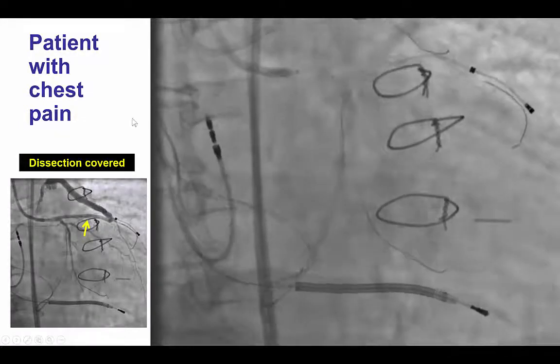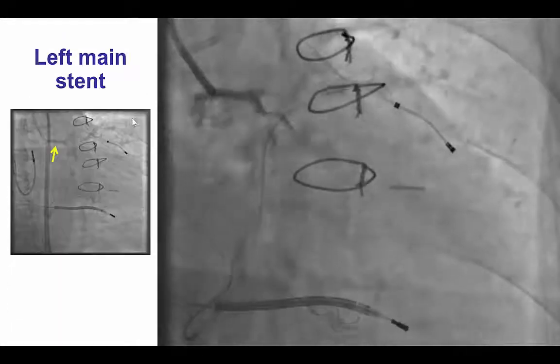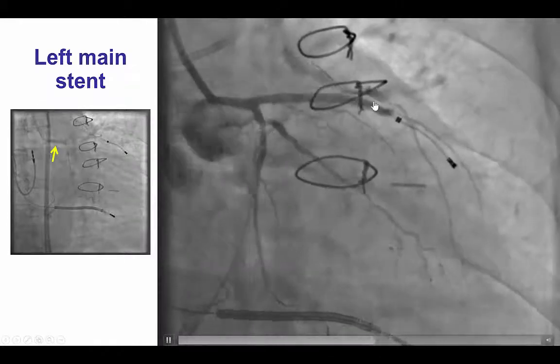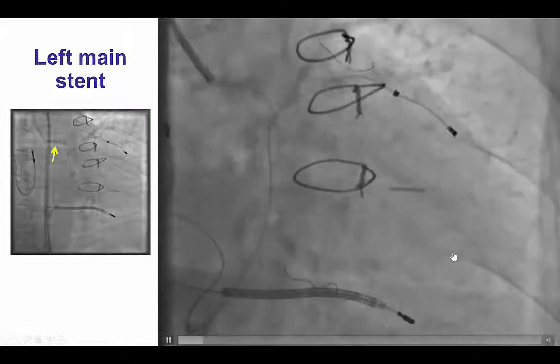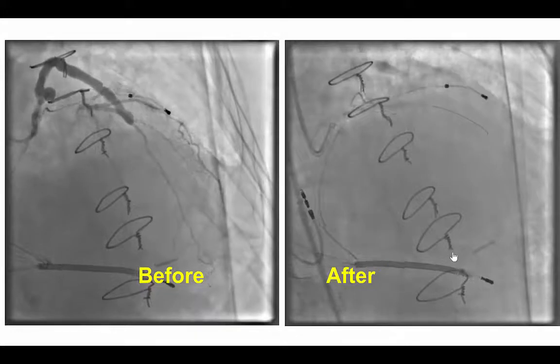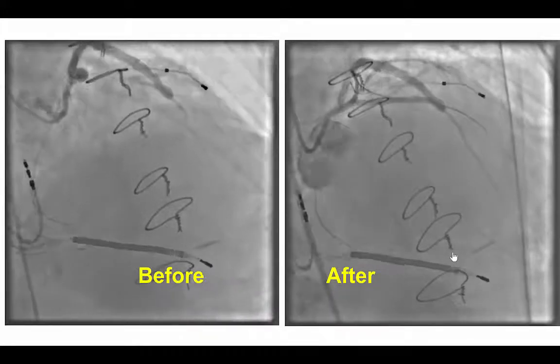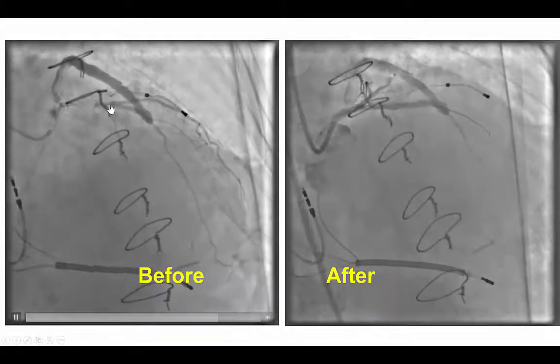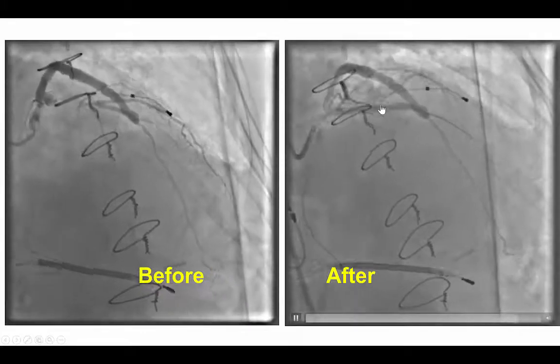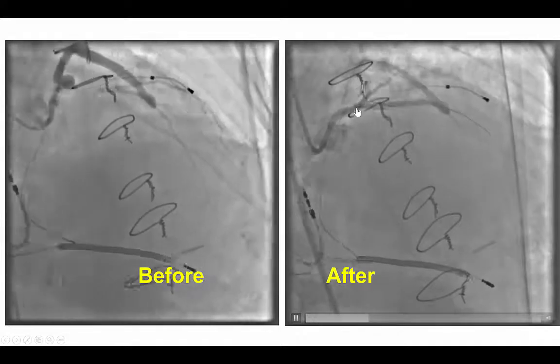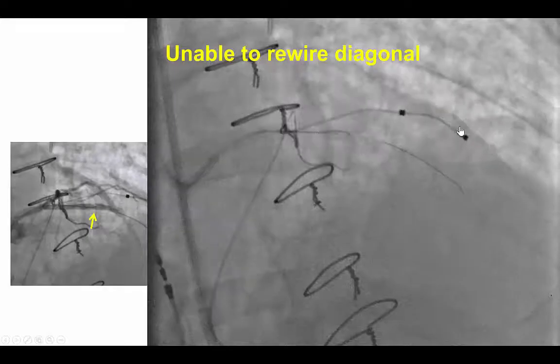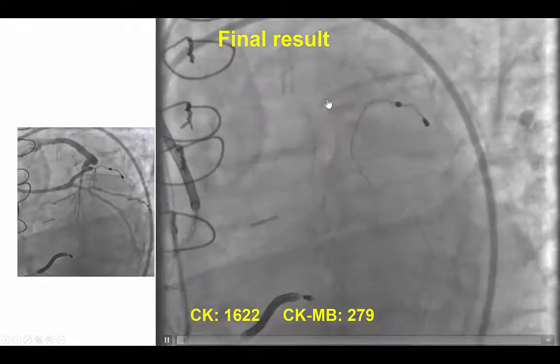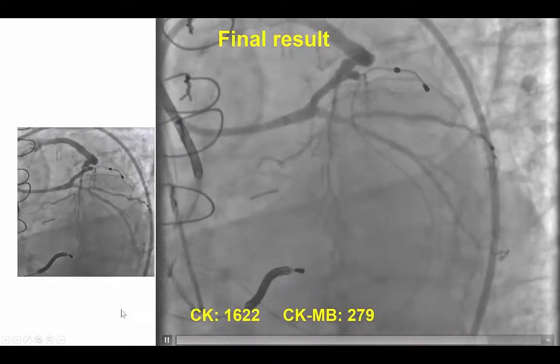However, the patient started having chest discomfort, and we had a question about why. We extended the stent into the left main given that we had been ballooning close to it, but the patient's chest pain did not change. We did have TIMI flow down the LAD, so it remained a mystery. Upon more careful review of the angiogram, the cause became apparent: we had inadvertently occluded a fairly sizable first diagonal branch originating immediately distal to the distal cap. That was lost after antegrade wire escalation into the second diagonal. Attempts to re-wire the diagonal were unsuccessful, and we had to accept loss of the side branch, leading to a periprocedural myocardial infarction. The patient did, however, have an uneventful recovery and was chest pain-free afterwards.